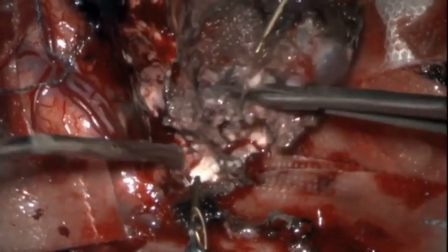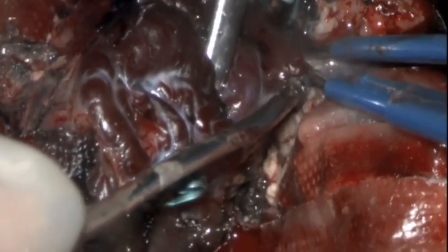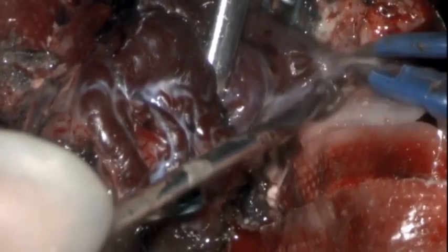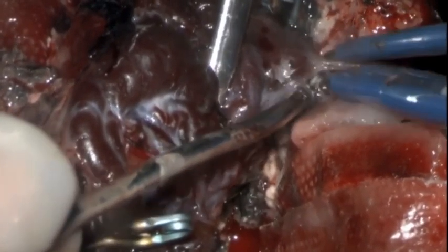The draining vein should turn from purple to blue. Once the bed is inspected for any additional attachments, the draining vein may be taken. At times, aneurysm clips or wet clips are necessary to secure the draining vein.